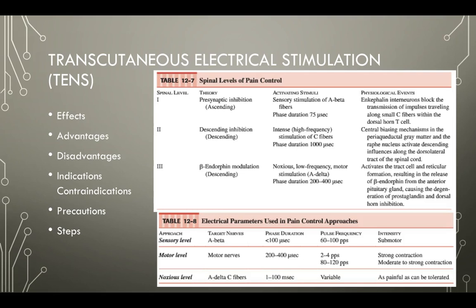But using TENS without a really good diagnosis and without doing other things could really just mask a more serious problem. So we want to make sure we always do our due diligence ahead of time. People can start to rely on it as a cure-all because it solves the pain, which is the main reason they came to see you. But again, it's not necessarily working on actually targeting the tissue that we need to for healing and recovery.